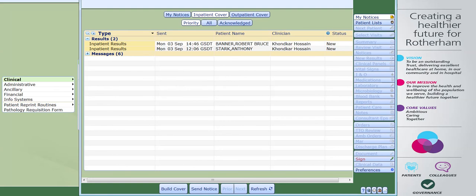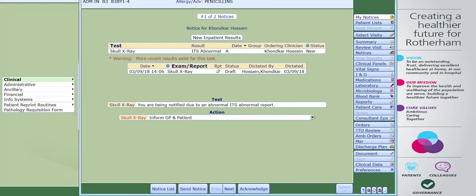Now that we are looking at your inpatient cover, the next thing you need to do is click onto the patient name of the result that you wish to see. This will load up the results acknowledgement screen. You will then see the type of test that has been carried out on the patient along with the ordering clinician and the date of the test. There is a text box at the bottom letting you know why it is viewable for you to action, along with any other information from the clinician or radiographer. To view the report, click onto the clipboard in the report column. After you have viewed the report, click onto the X to return to the acknowledge report screen.